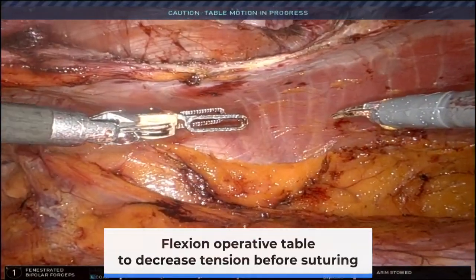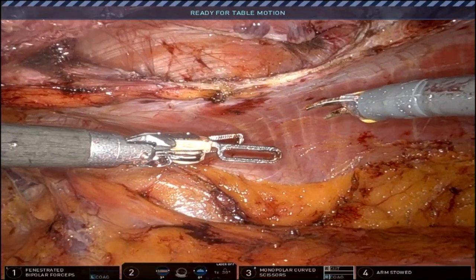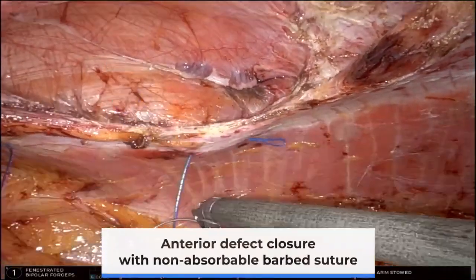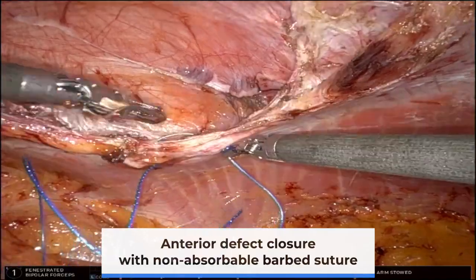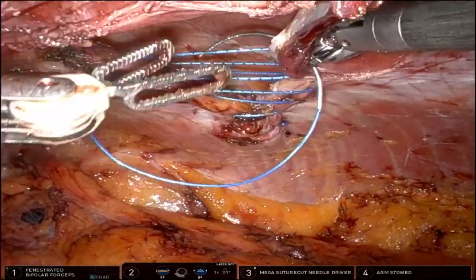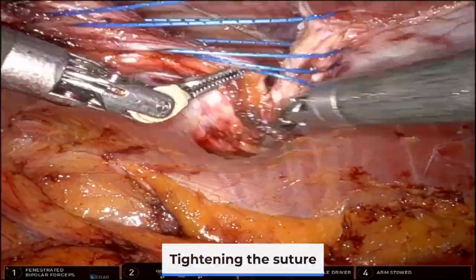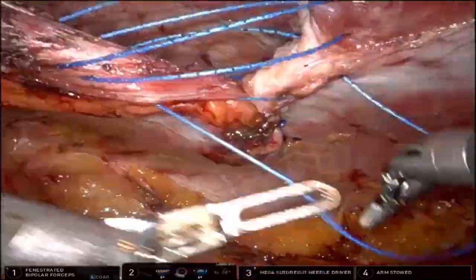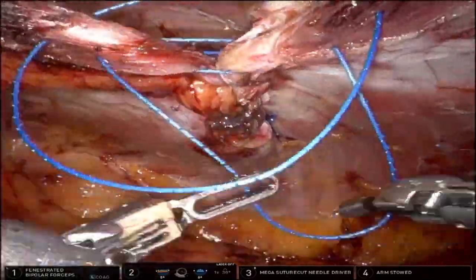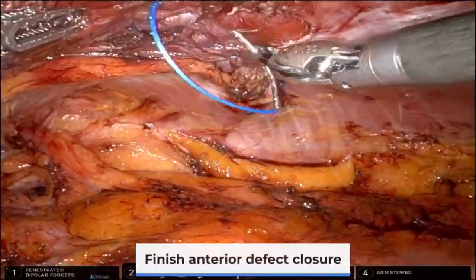Flexion of the operative table to decrease tension before suturing. Anterior defect closure with non-absorbable barbed suture. Tightening the suture. Finish anterior defect closure.